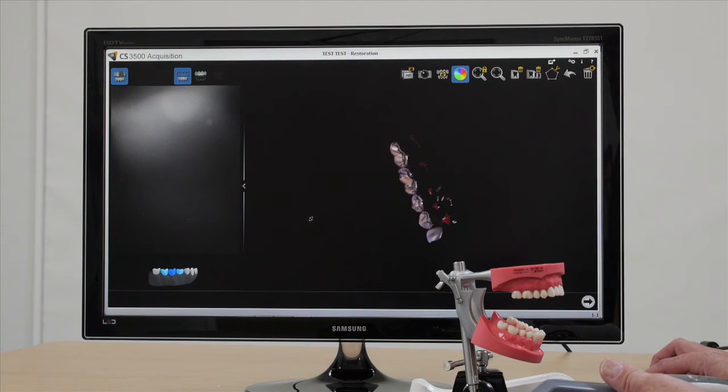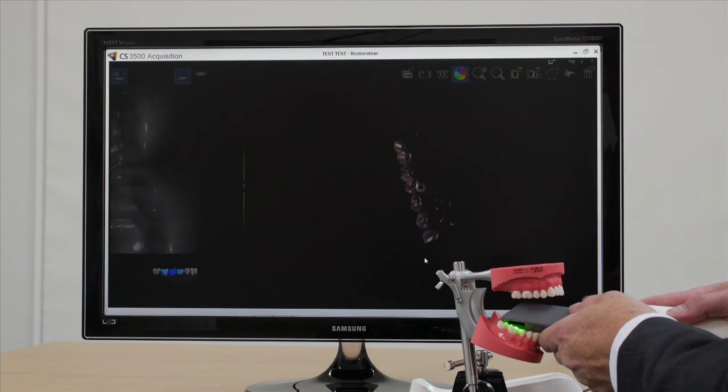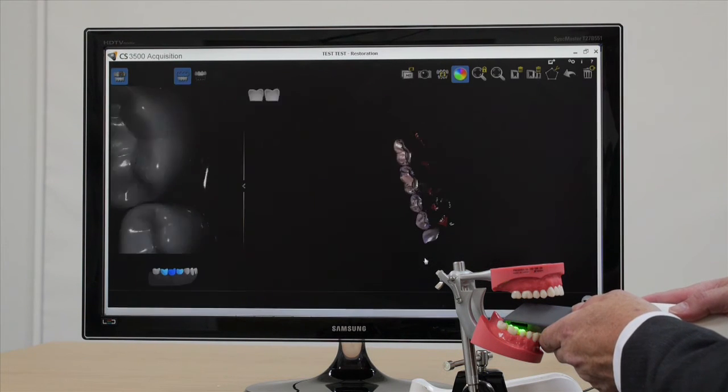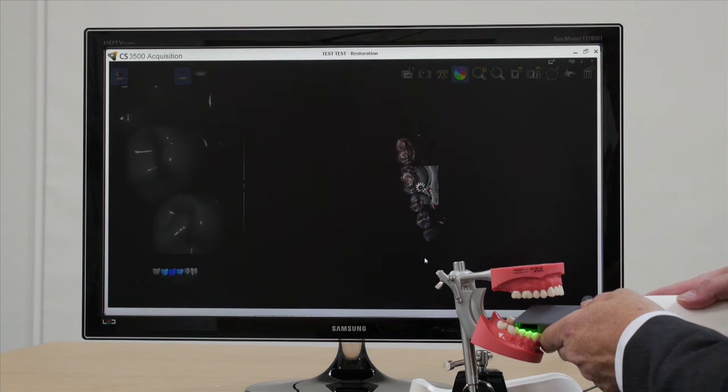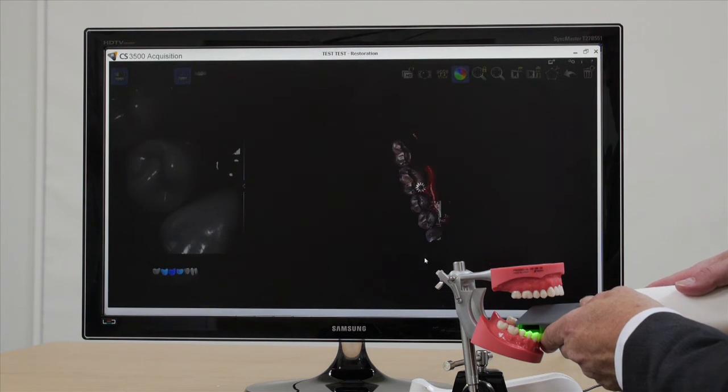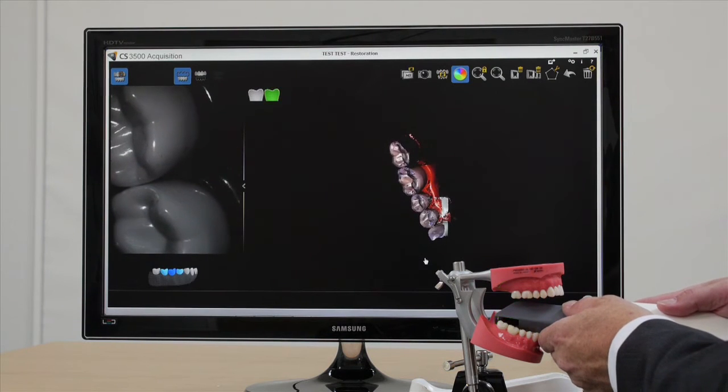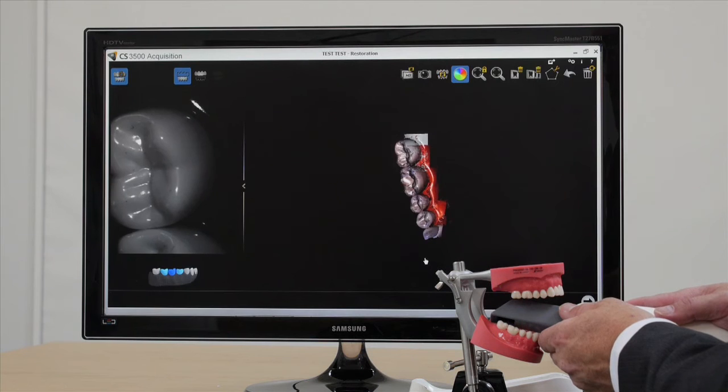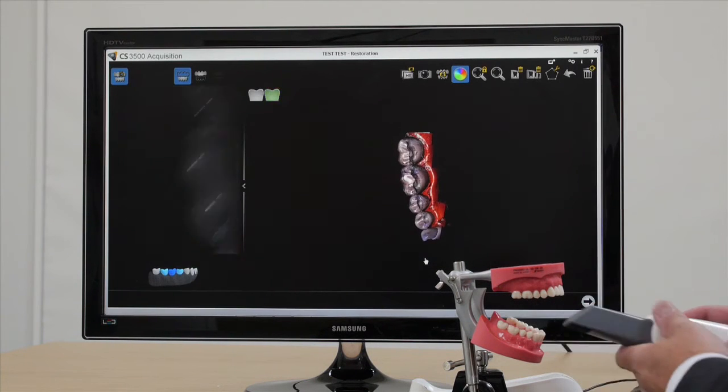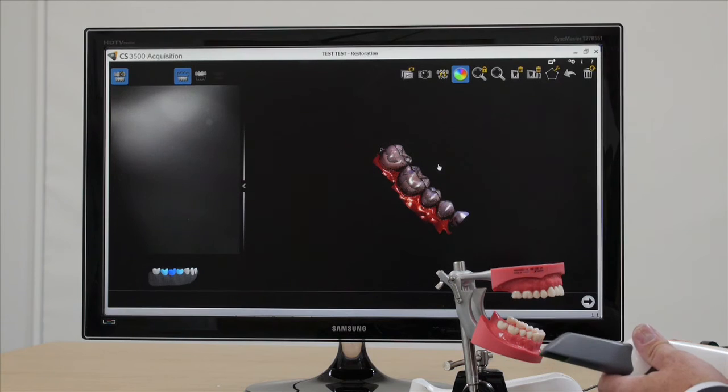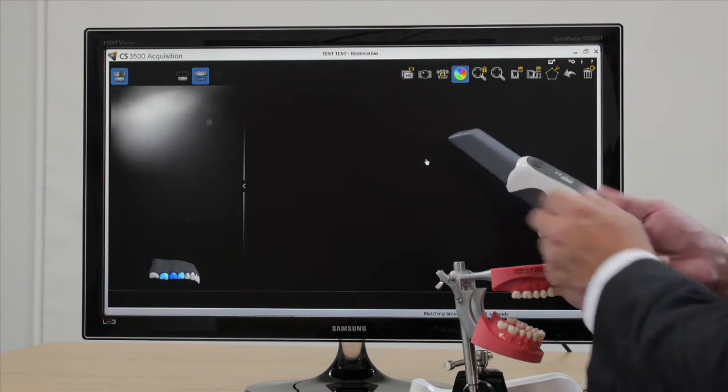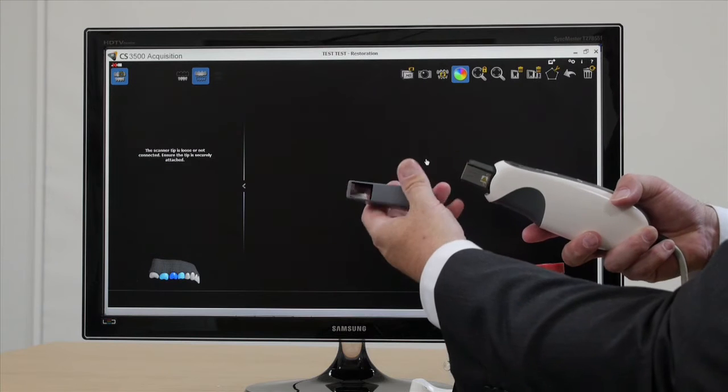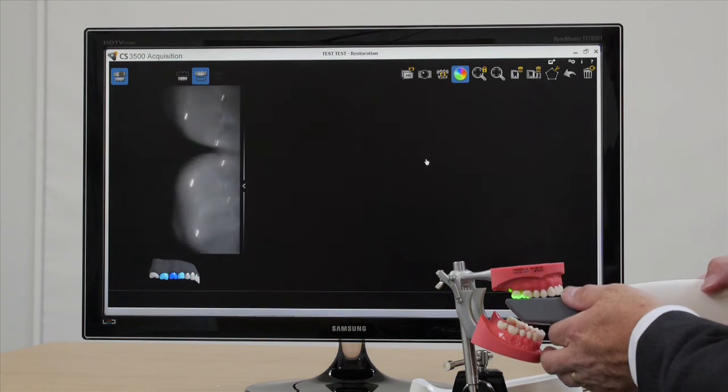Let's capture lingual now. And then for the purposes of this tutorial, we will then move to the upper arch. And it's entirely up to the clinician to decide what gaps to leave and what gaps to let our software fill in. So let's just have a look here. Good. Good to go. With our button, we'll swap to the upper arch. Now you can just remove the tip and turn it round and away you go for the upper.